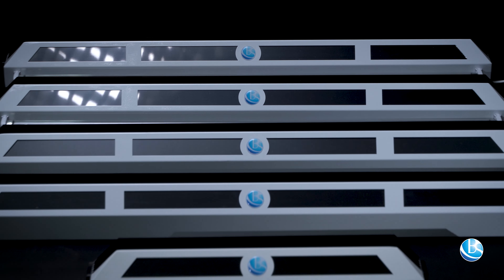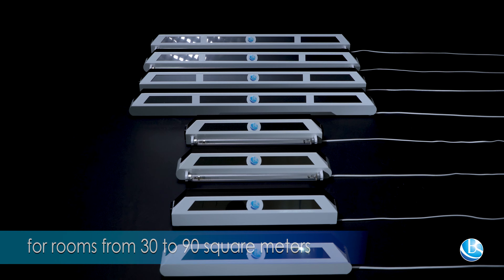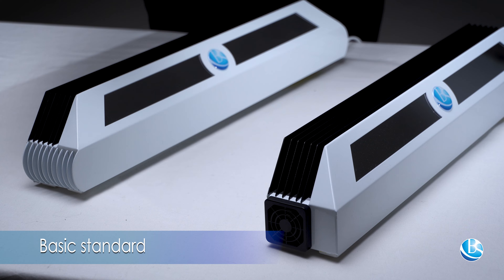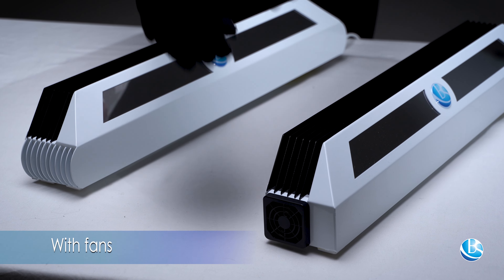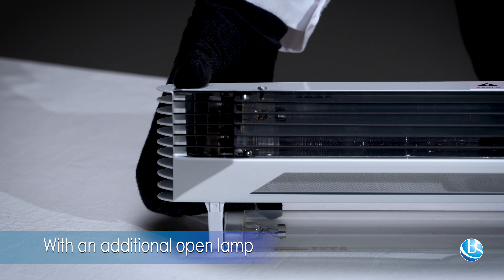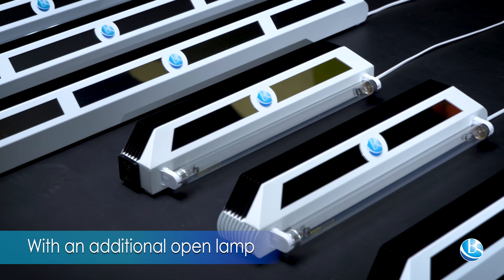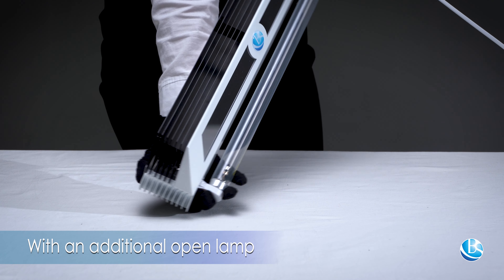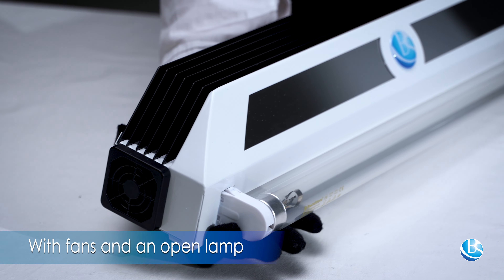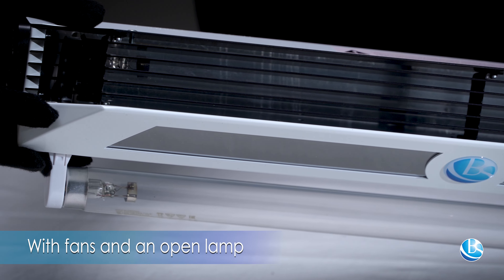There are short and long models for rooms from 30 to 90 square meters, available in four configurations. Basic and standard with fans for accelerated disinfection; with an additional open lamp for disinfection of surfaces in the room — which requires the absence of people and animals; and a combined version with fans and an open lamp that combines the advantages of the two previous configurations.